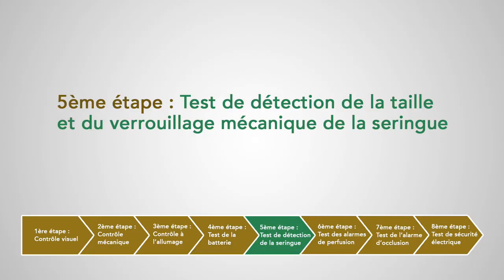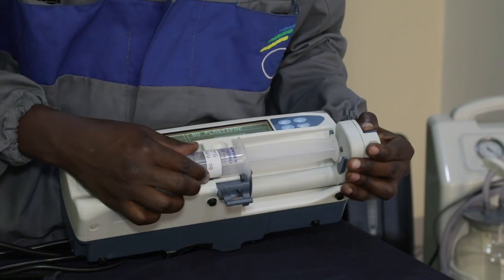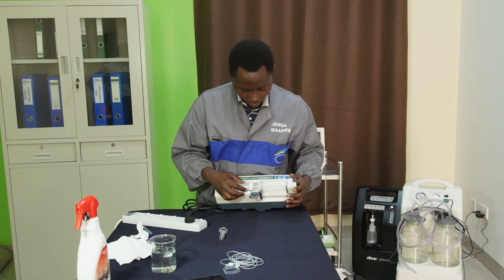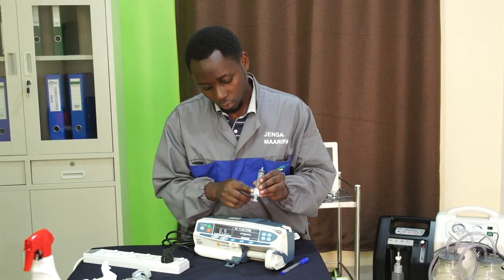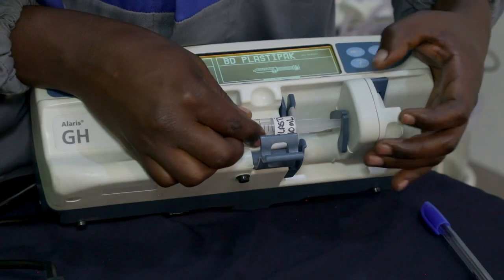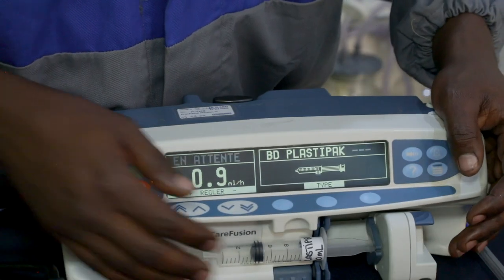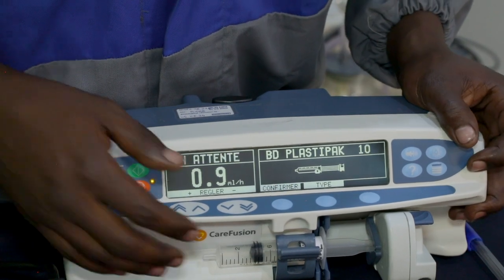Cinquième étape : test de détection de la taille et du verrouillage mécanique de la seringue. On va insérer la seringue de 50 ml sur notre appareil et vérifier que le pousse-seringue indique qu'une seringue de 50 ml est insérée, ou sélectionner sur le pousse-seringue la marque et le volume approprié. On refait la même chose avec notre deuxième seringue de 10 ml et on vérifie que notre appareil indique bien une seringue de 10 ml.